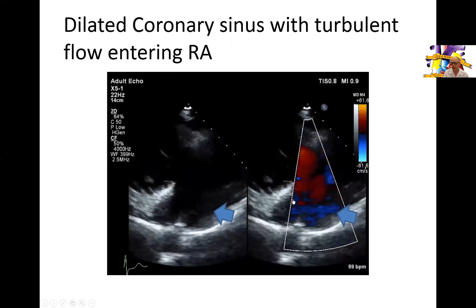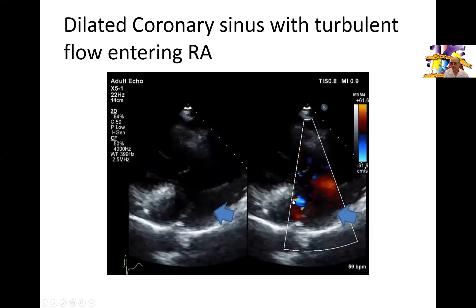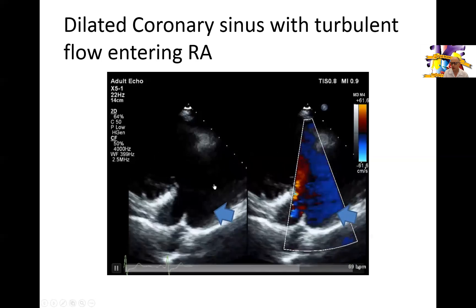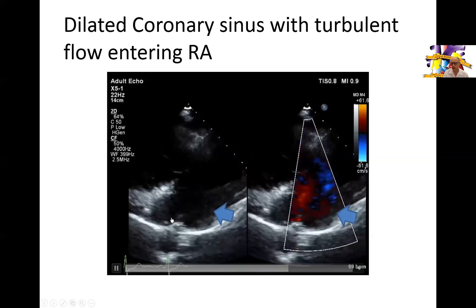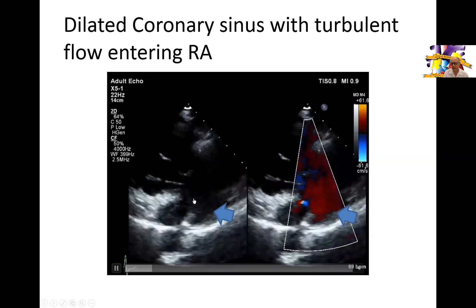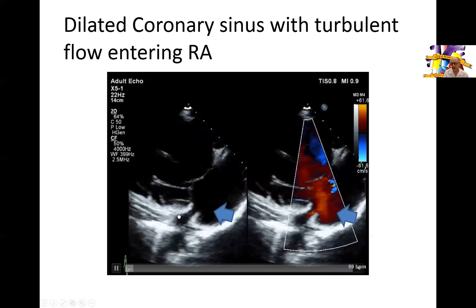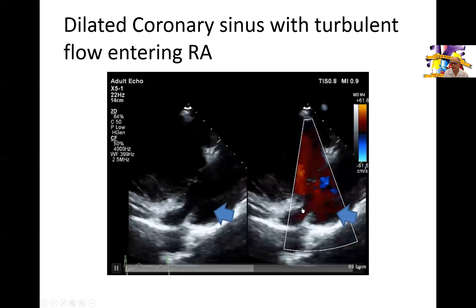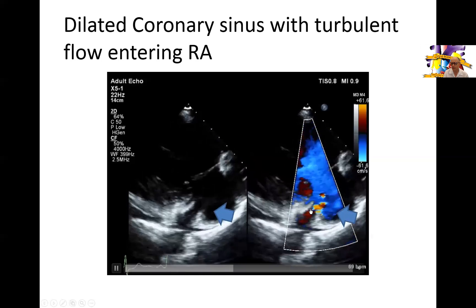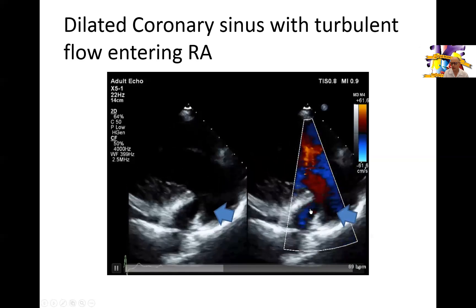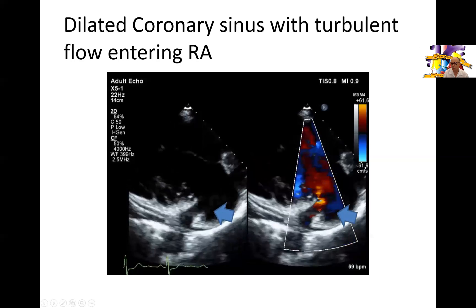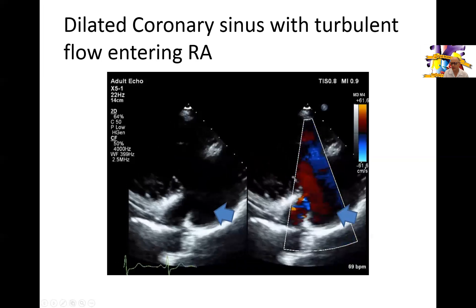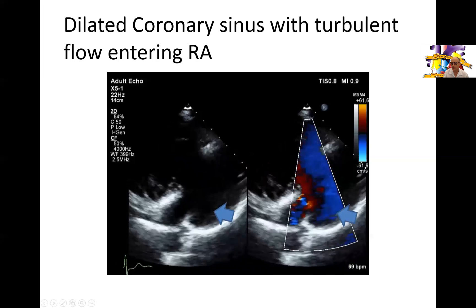Then we move to a modified right-sided view where the first thing you notice is the coronary sinus emptying into the right atrium — it appears dilated — and you can also see some flow into that coronary sinus, with some turbulence at least at the mouth of the coronary sinus as it empties into the right atrium.